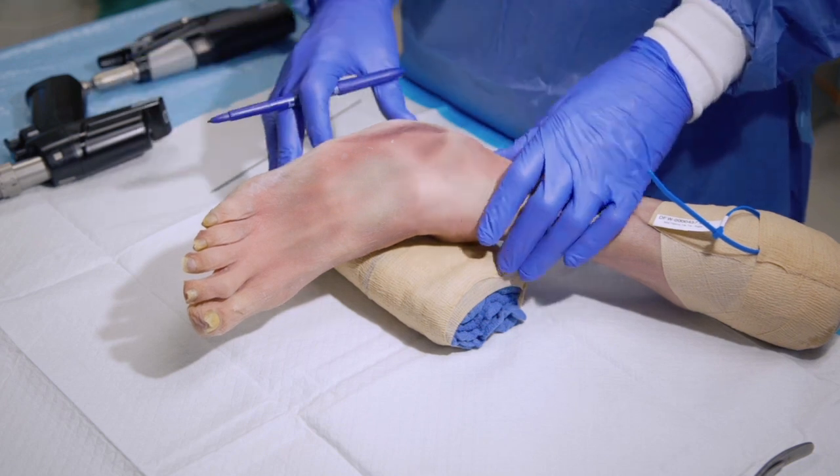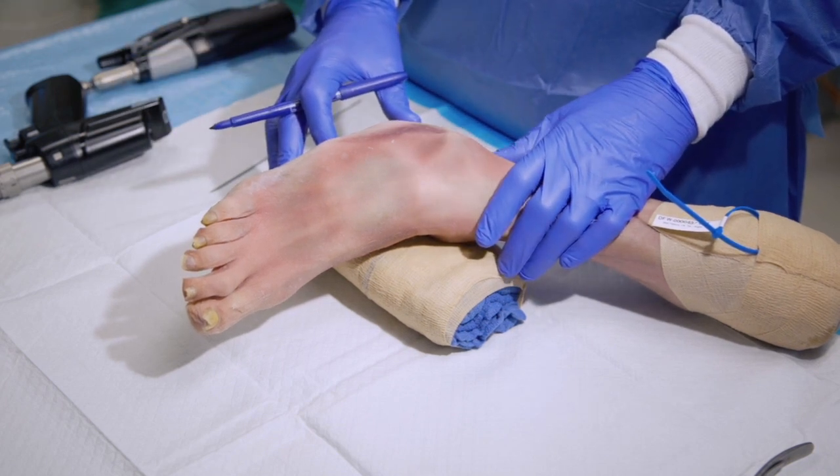Today I'll be demonstrating the Acinus Jones Fracture System with New Targeting Guide. Here we'll be demonstrating the incisional approach to the Jones Fracture.